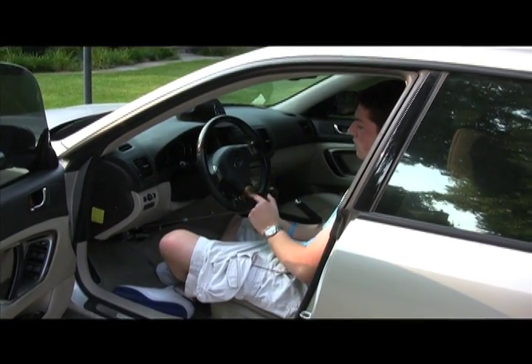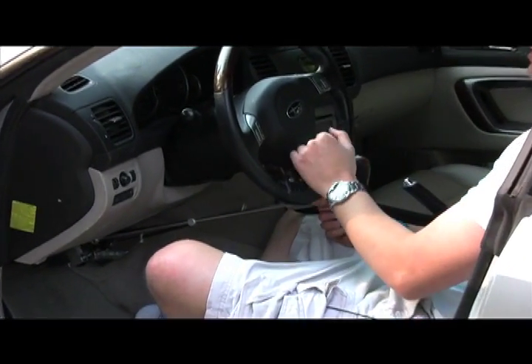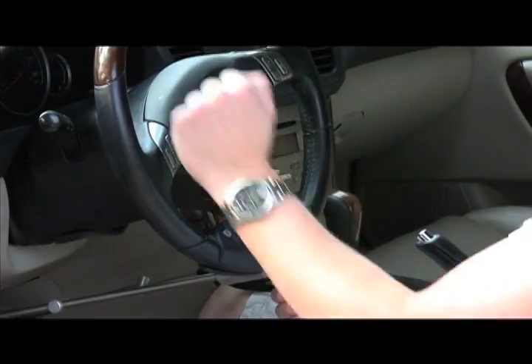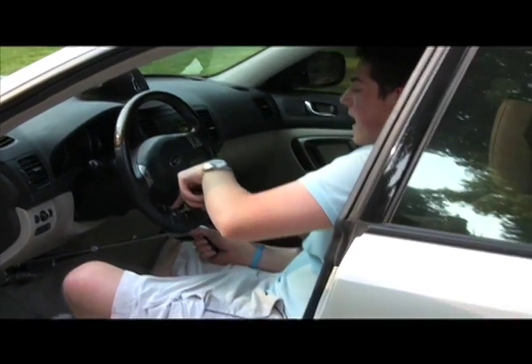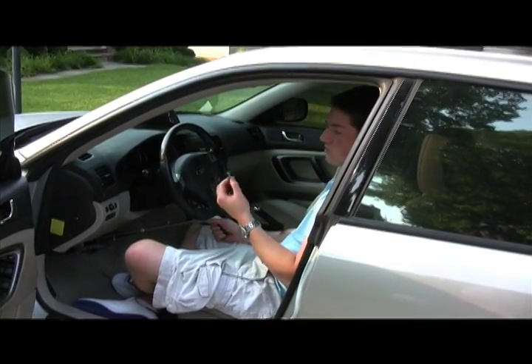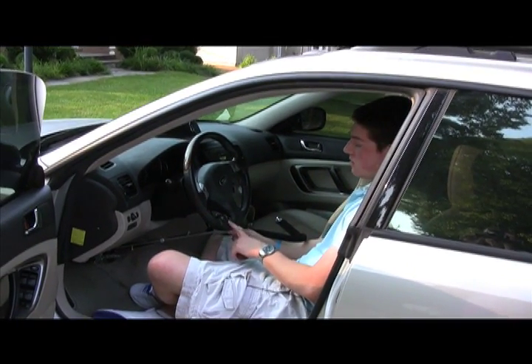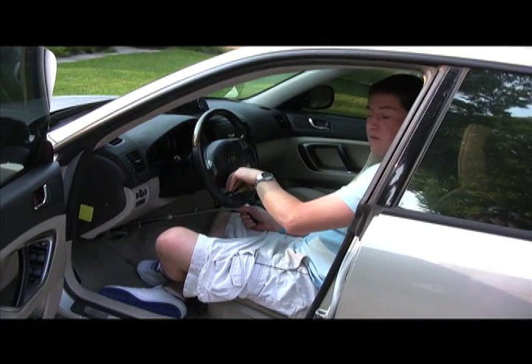This right here is called a spinner knob, also known as a suicide knob. This makes it really easy for maneuvering in parking lots because it gives you a different angle on the wheel to be able to turn it very fast. I recommend getting one that you can detach because especially when you're going to have somebody who's able-bodied driving your car, it's illegal for them to have this on. It's very legal for you to have on. It's a very good assistive device and I highly recommend it.